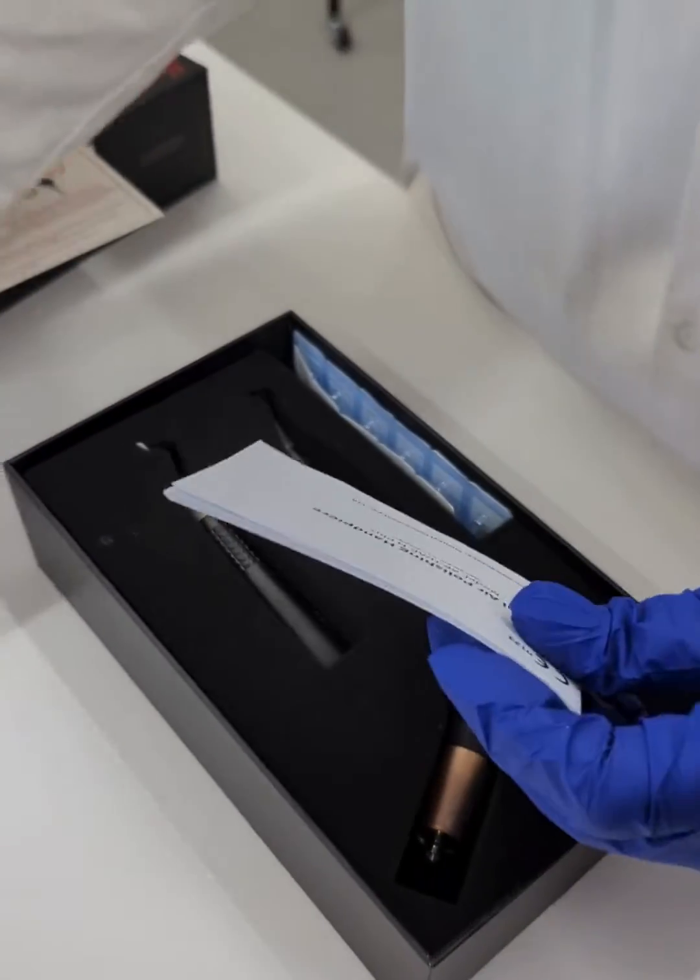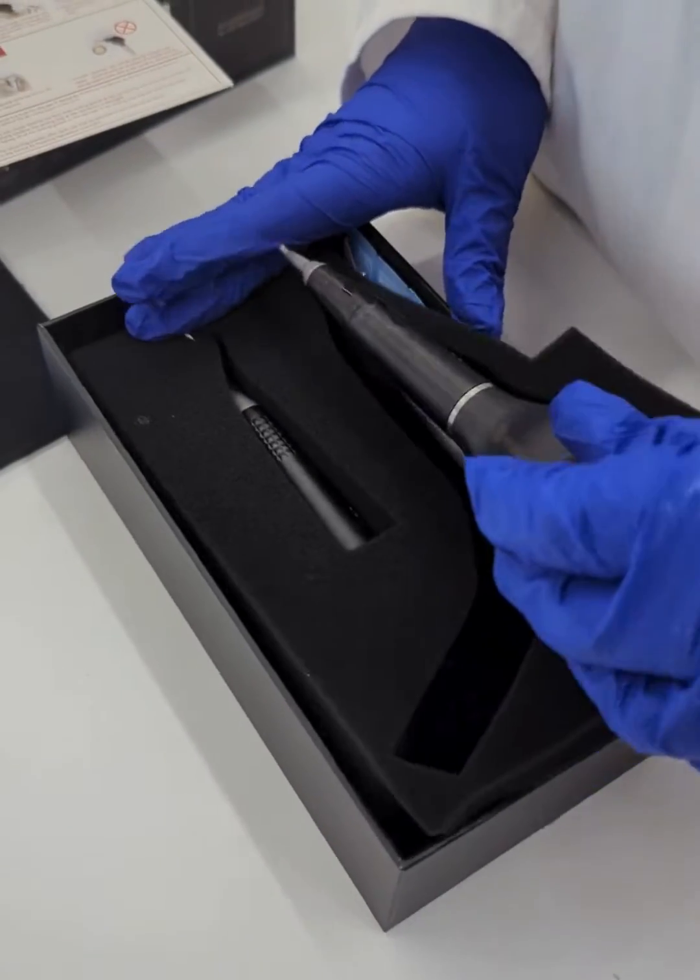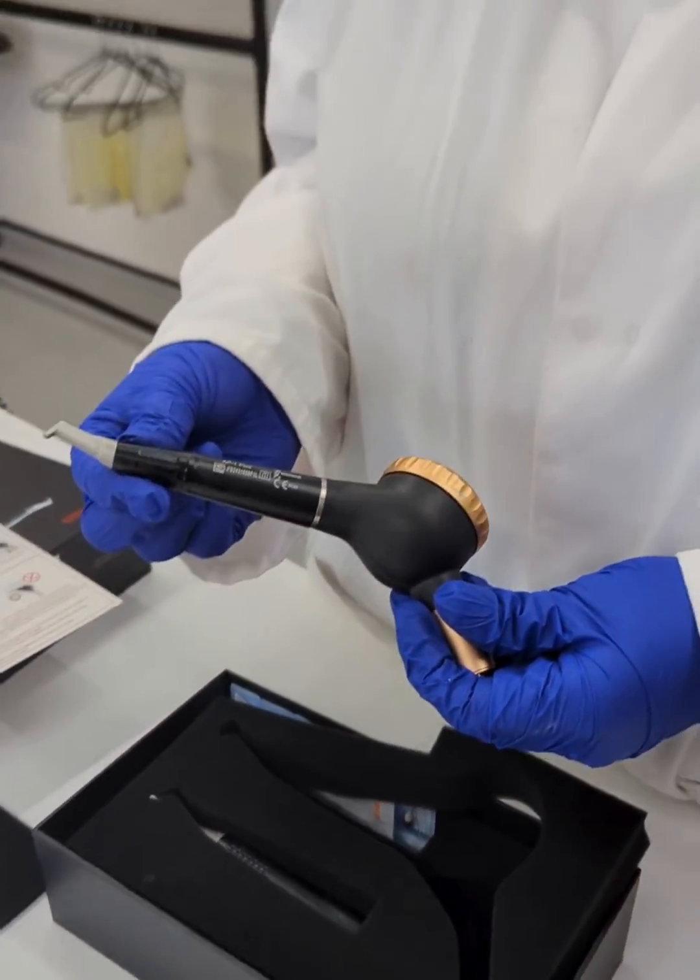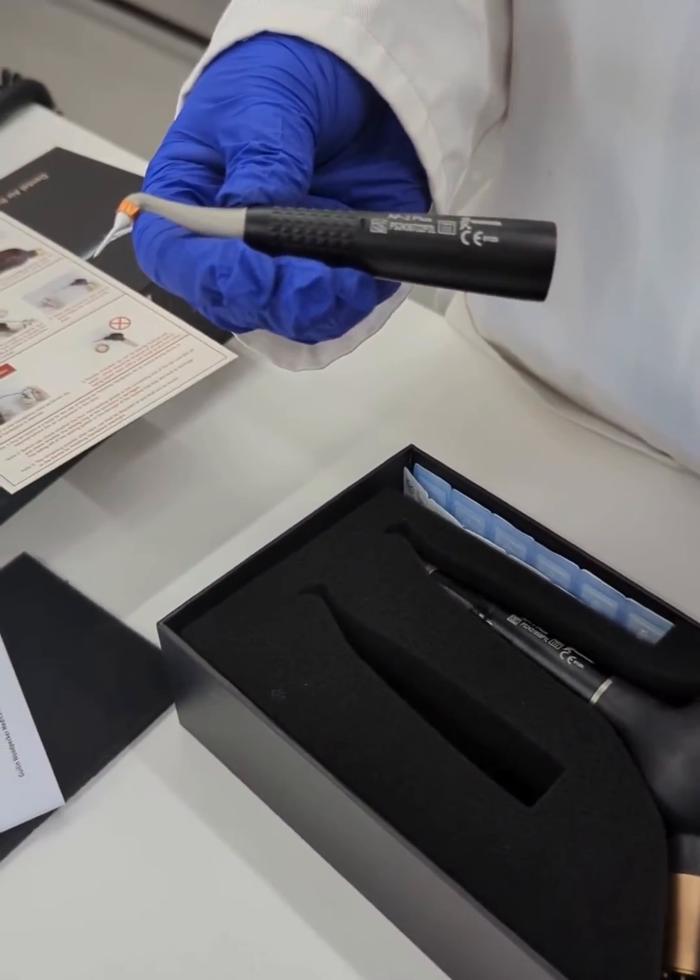Underneath that, you will have the instructions and also it will show you the handpiece. Now you get the handpiece with a prophy tip and you also get the sub-gingival perio tip as well. So it's two in one.